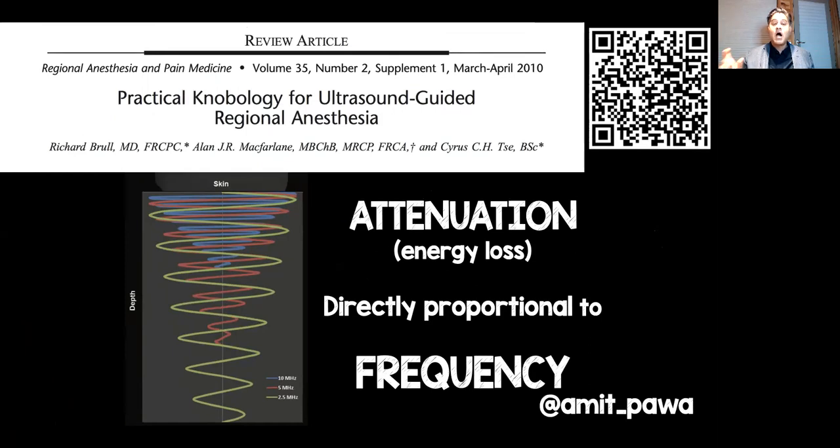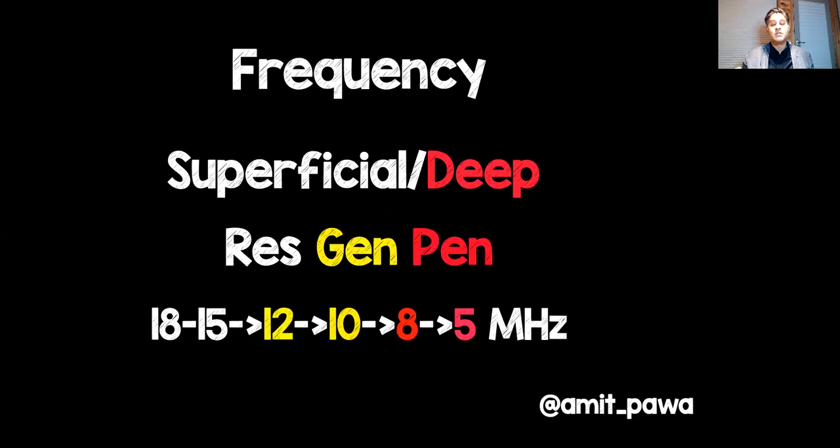Now, clearly high frequency ultrasound travels a short distance before the beam gets attenuated. Lower frequency travels much further. So attenuation is directly proportional to the frequency.